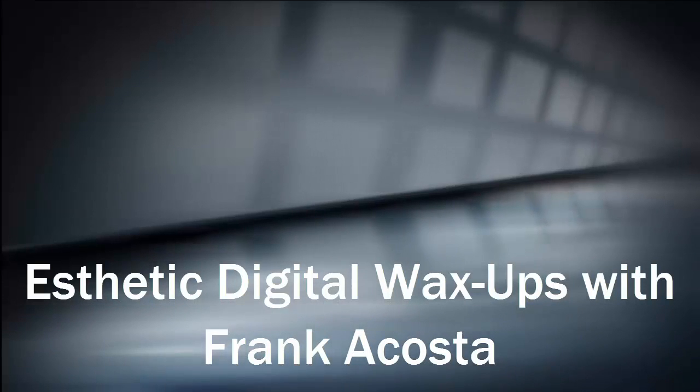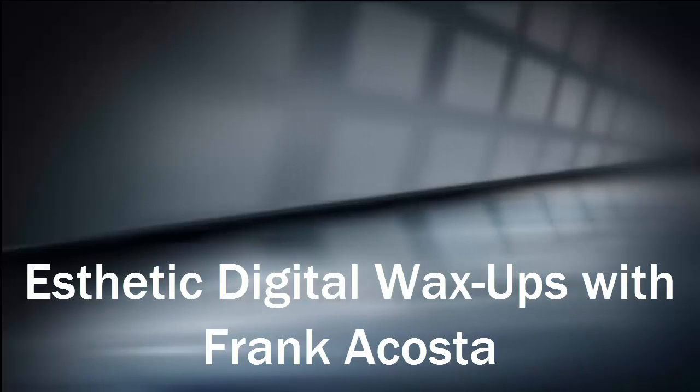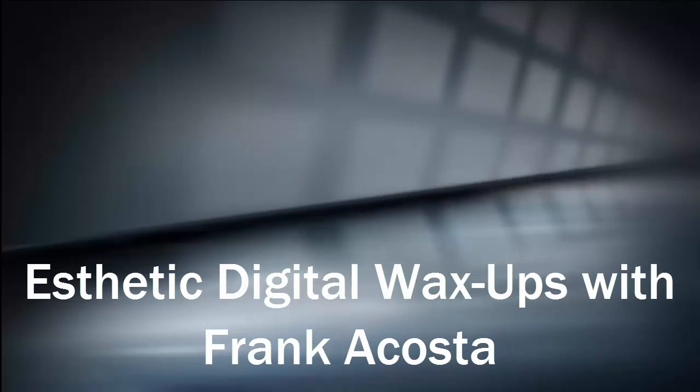Hi, this is Frankie from AA Dental Design, and today we're going to be talking about Aesthetic Digital Wax-Ups using the InLab 15 and the MCX-5. In our laboratory, when cases come in that doctors want wax-ups, no matter if it's coming in through Serac Connect or if it's conventional impressions, everything is basically processed through the InLab 15.